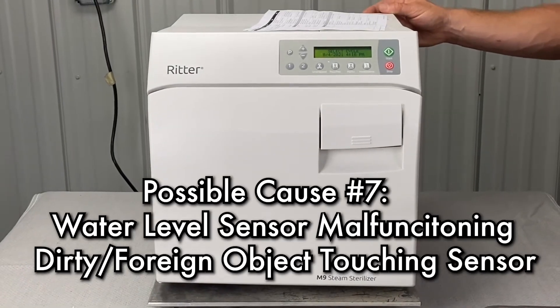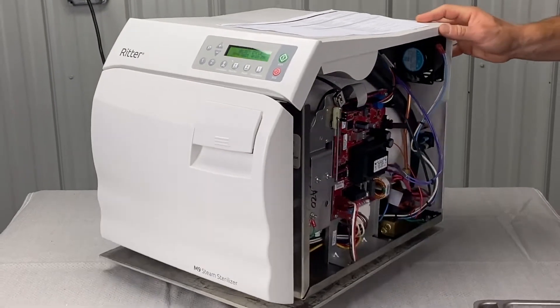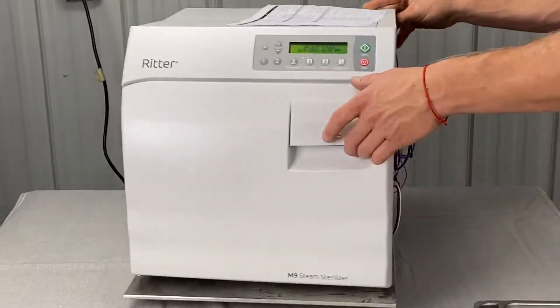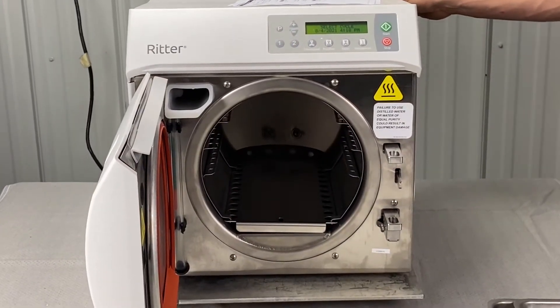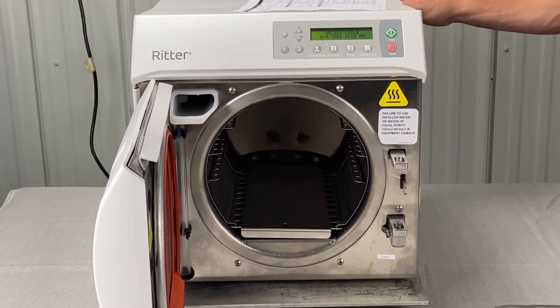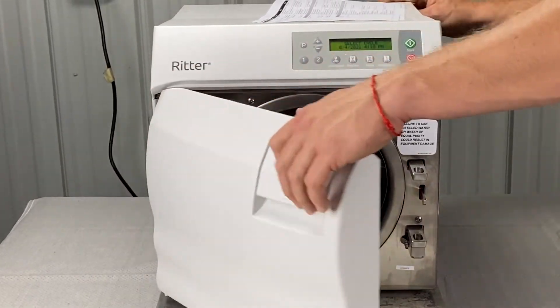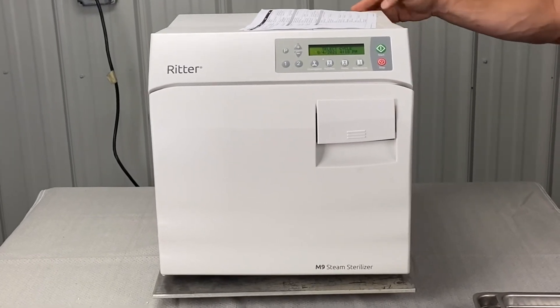The water level sensor may be malfunctioning due to dirt or foreign objects touching the sensor. When cleaning the mesh filter, also visually inspect inside the chamber in the back where the water level sensor is. Make sure there's nothing touching it — no paper, no buildup back there. Give us a call and we can talk you through that; it's not usually a common issue.